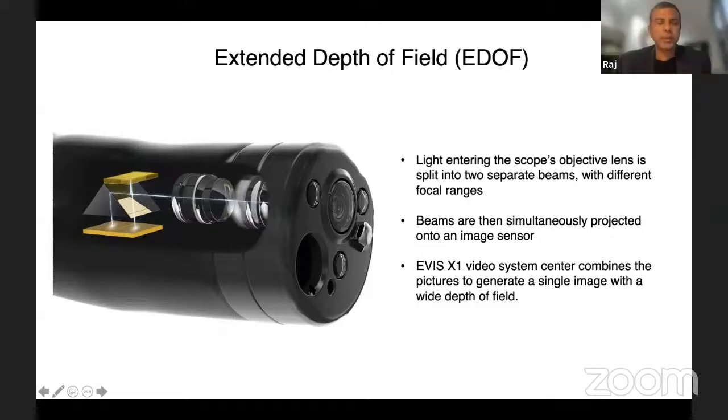I think the most useful component to this, as Philip mentioned, is that you are able to see what's in front of you and what's at the back of the area of focus. So it gives you a more wide field view of what's occurring. But especially so is the ability to then magnify the area of focus.